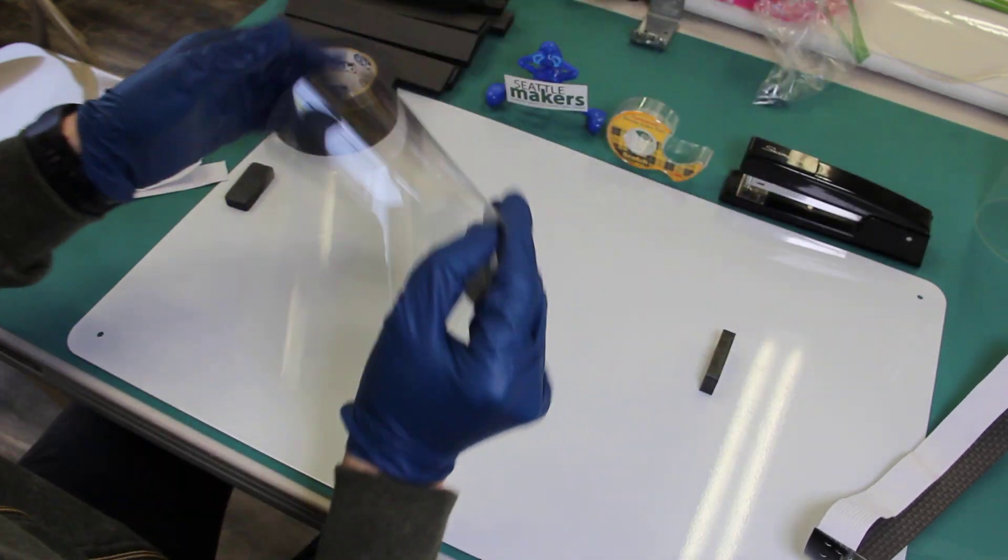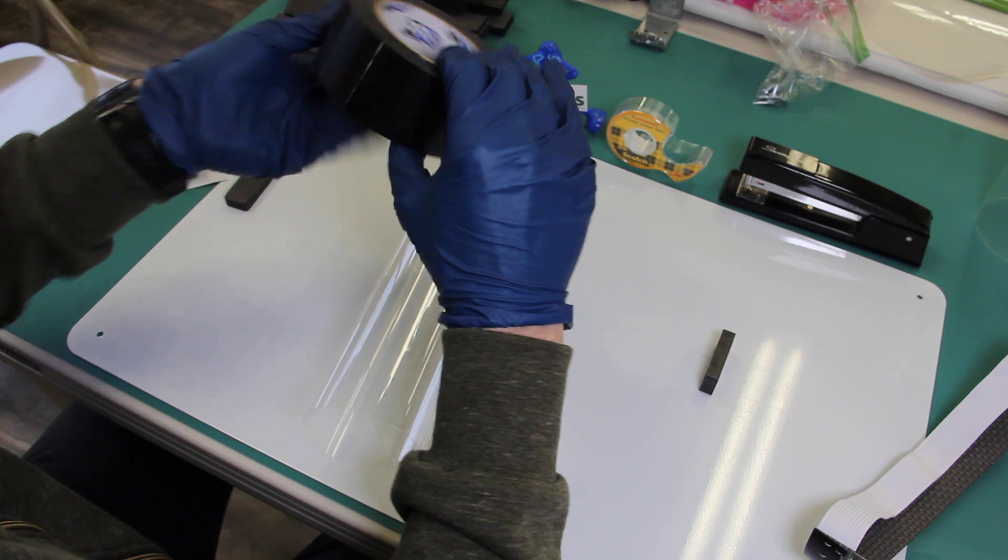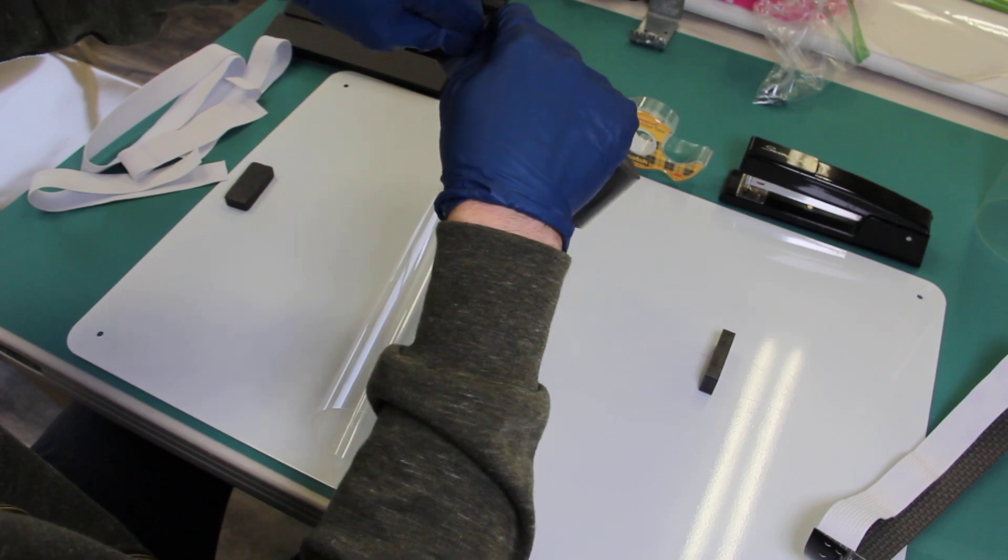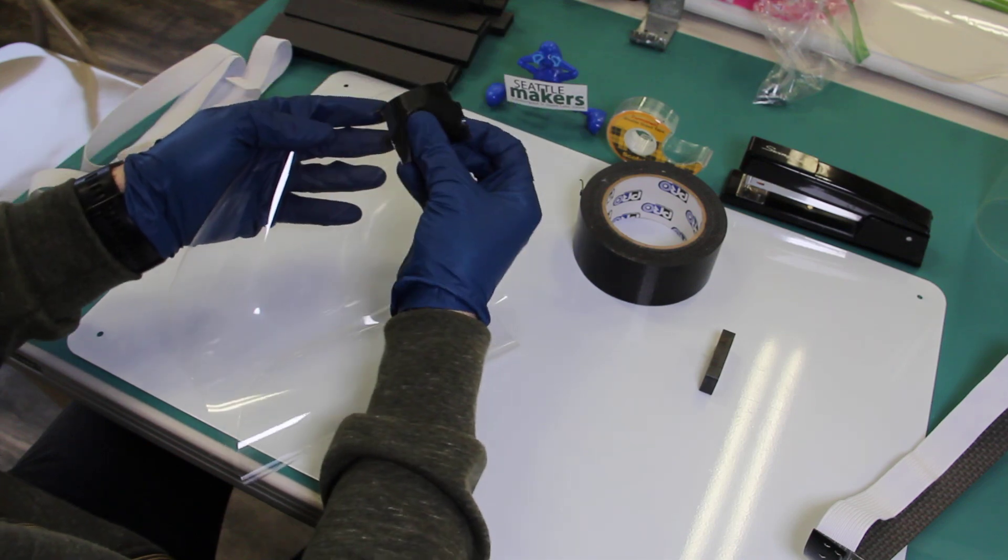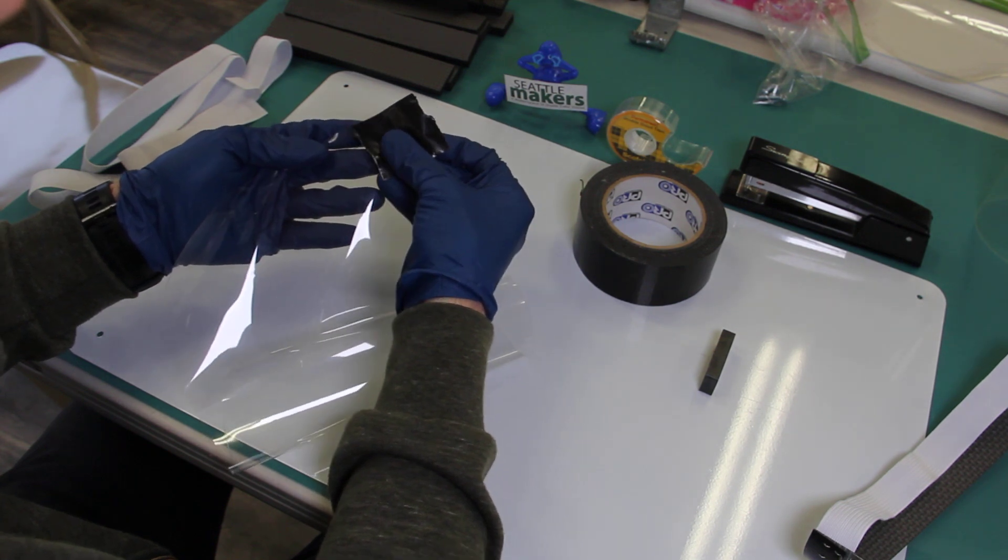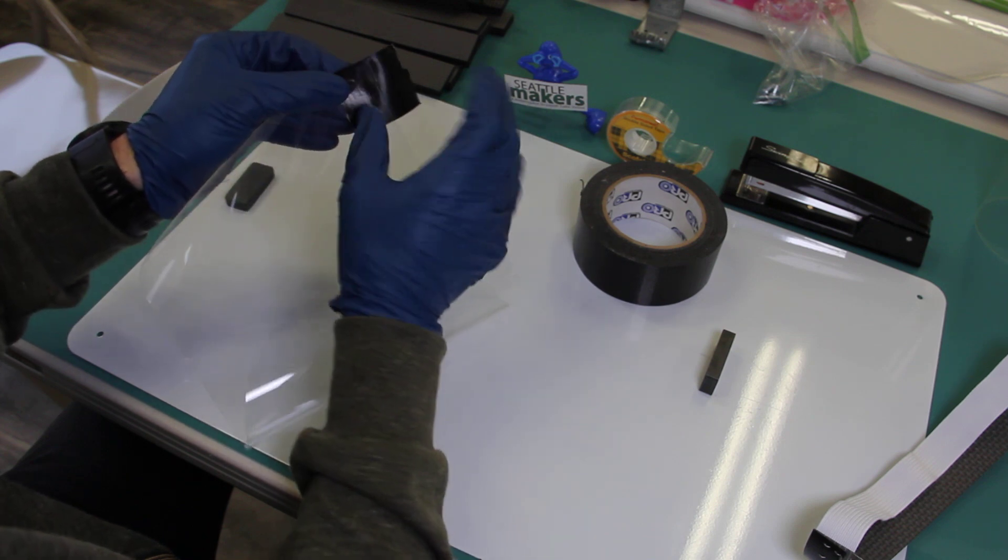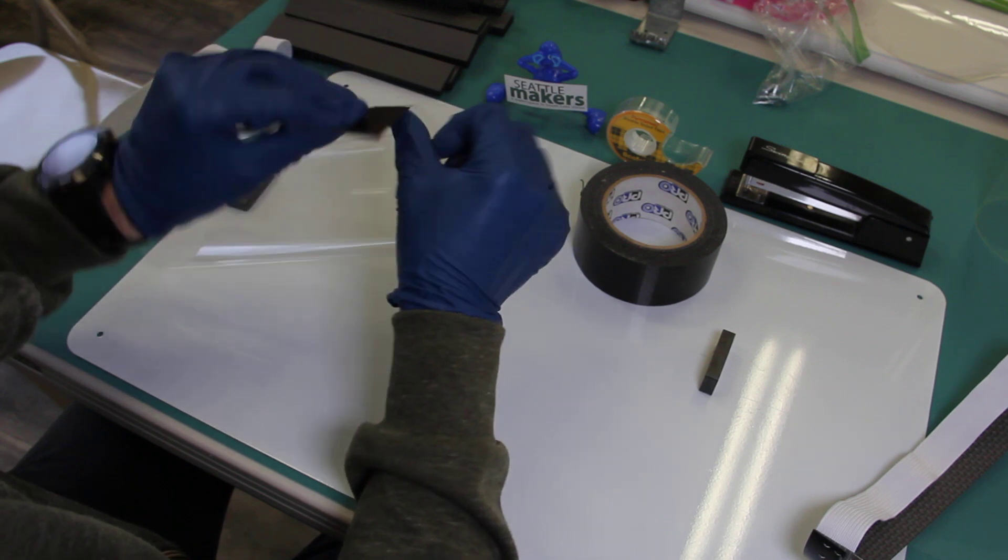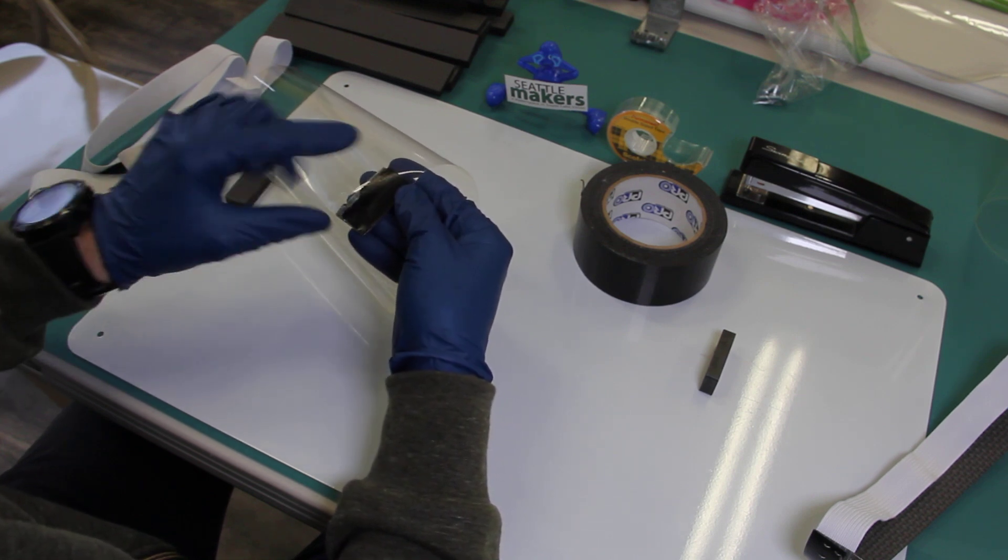First off, we're going to want to reinforce the top corners where the staples go, and to do that we're going to tear off about a square of this duct tape. Take the straight edge along the top left corner, line it up with about half of it sticking above the mask, and this doesn't have to be perfect. We're looking to just have the width of a staple fit in both sides.